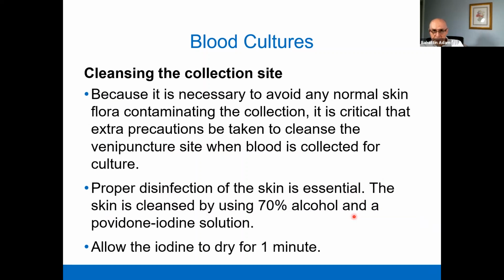Okay, obtaining a sample for blood culture is really important. We have to pay attention and be careful.